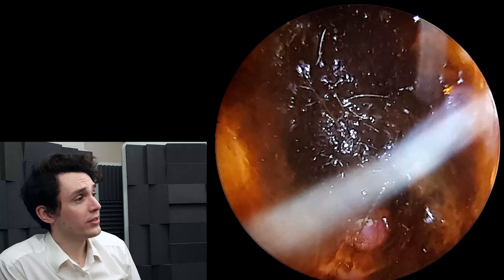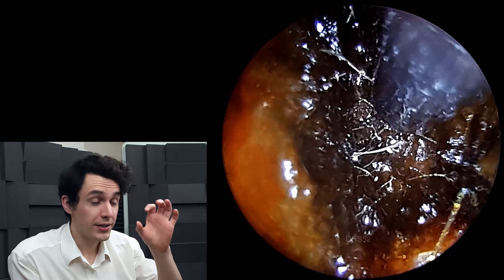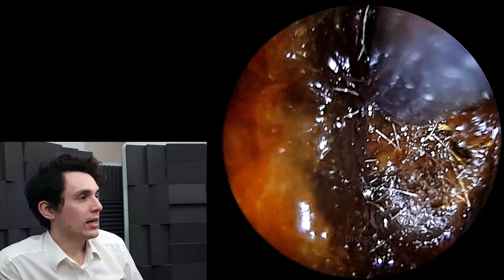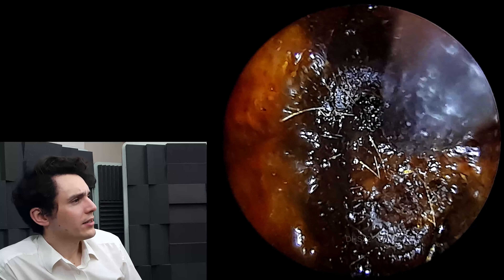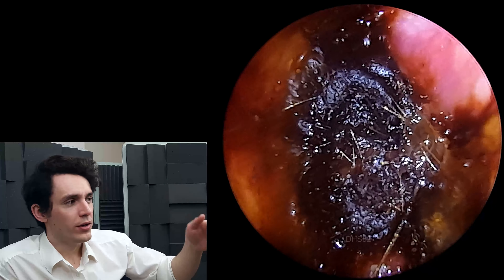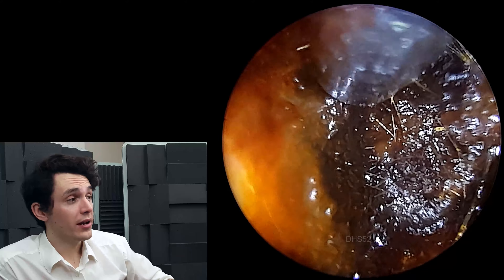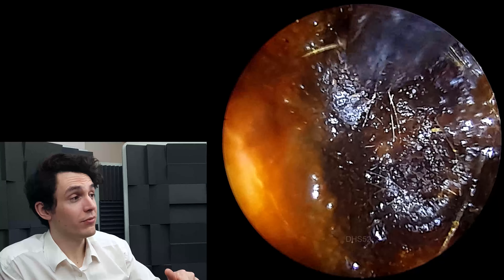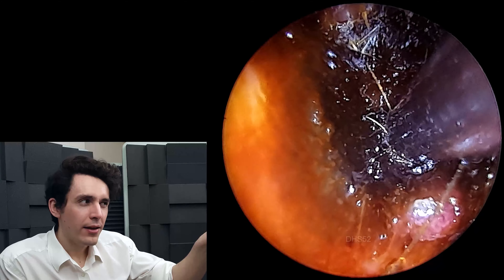I do have loops — a couple of sets. They're like glasses but with magnification lenses over your eyes, the type of thing a dentist would use to get a close-up image of your teeth. The vision is not as good as an endoscope though. So here I'm doing some work very deep in the ear canal. I'm fairly sure that right in the center of the frame there is wax, and I'm fairly sure the eardrum is right on the other side of that. In these cases I'm always getting a little cautious — I don't want to be aggressive with the suction and do some damage to the eardrum lurking right behind that layer of wax.